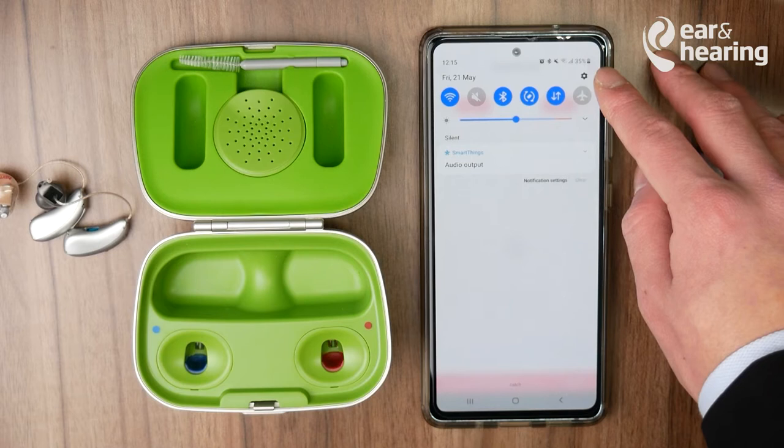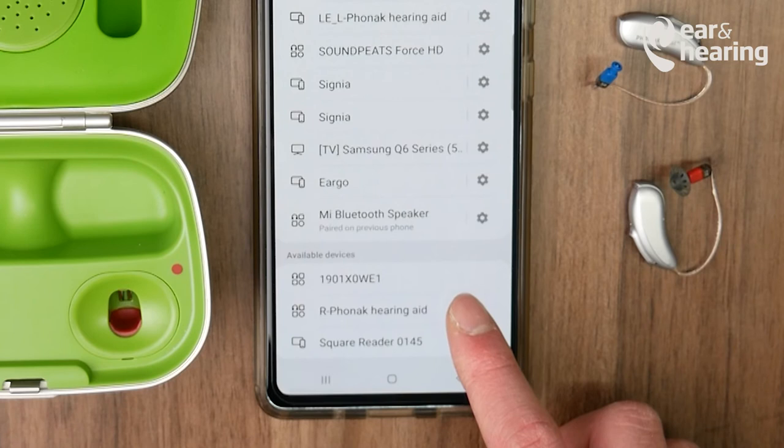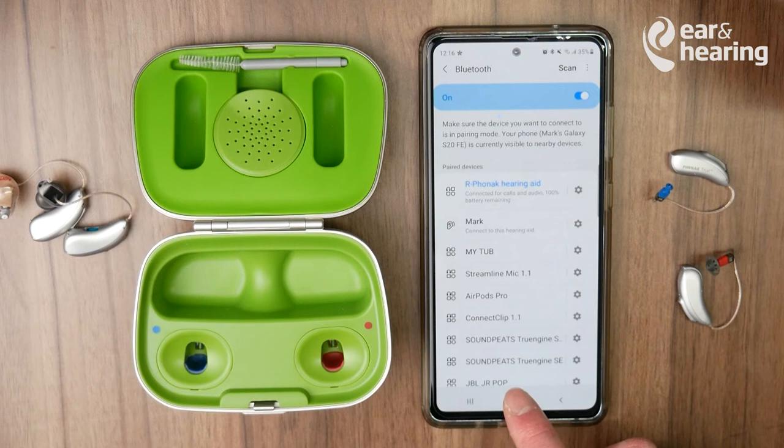Once you've done that, swipe down and click on the settings menu. In the settings menu, click on Connections and Bluetooth. Most phones have a similar layout to this. Scroll down to the bottom and find your Phonak hearing aid, then press Pair. You should see the right Phonak hearing aid has appeared at the top.